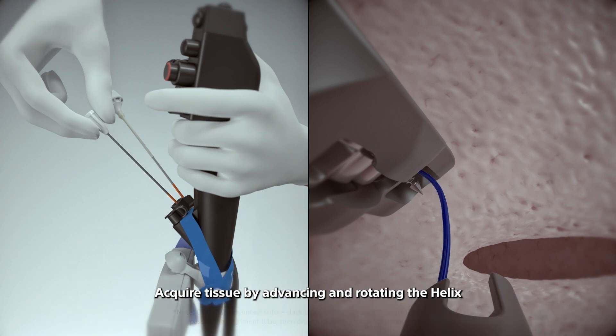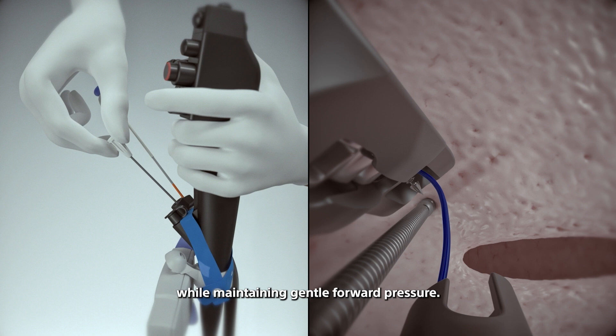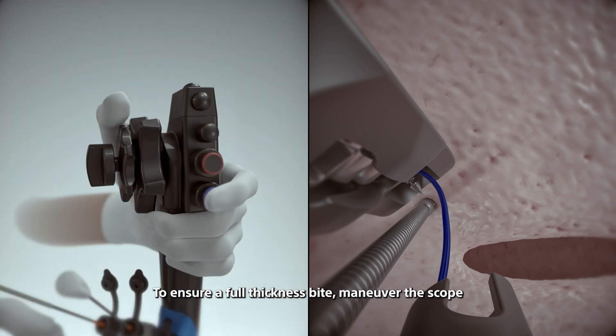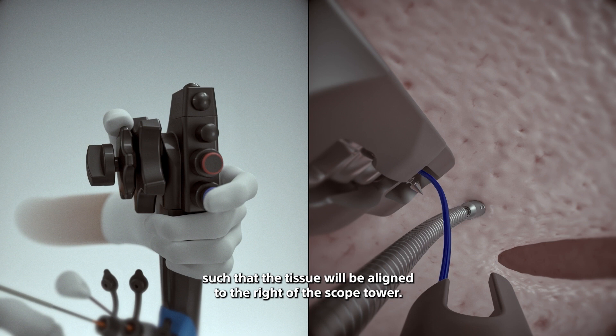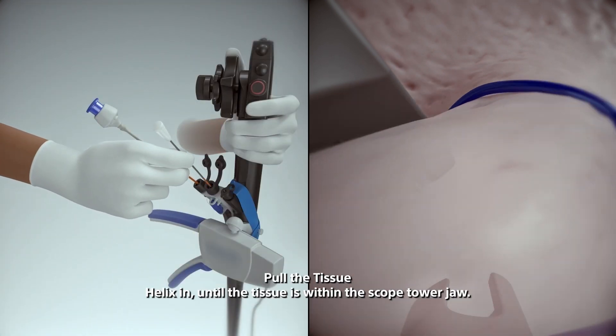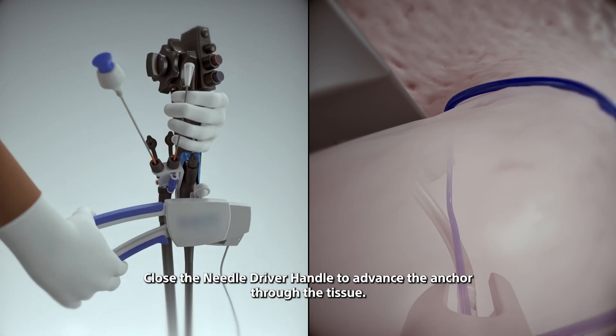Acquire tissue by advancing and rotating the helix catheter or handle clockwise until desired tissue depth is achieved while maintaining gentle forward pressure. To ensure a full thickness bite, maneuver the scope such that the tissue will be aligned to the right of the scope tower. Pull the tissue helix in until the tissue is within the scope tower jaw. Close the needle driver handle to advance the anchor through the tissue.